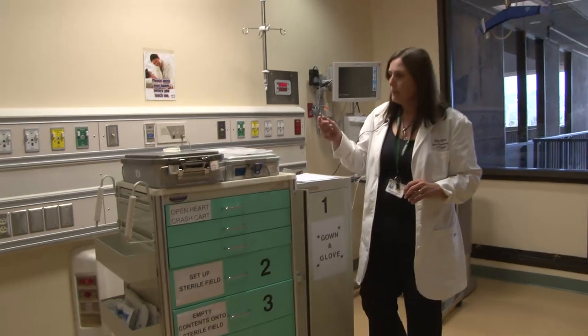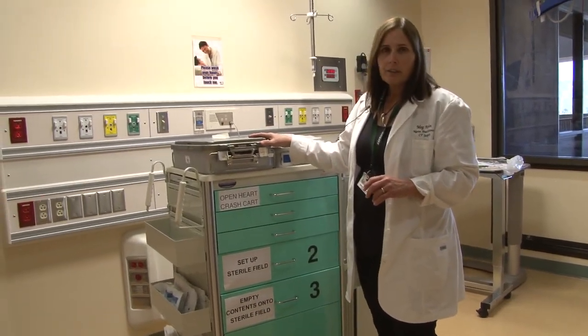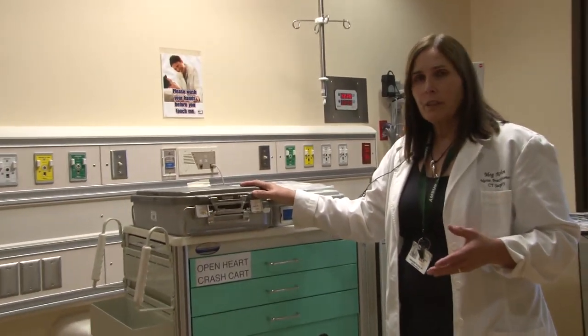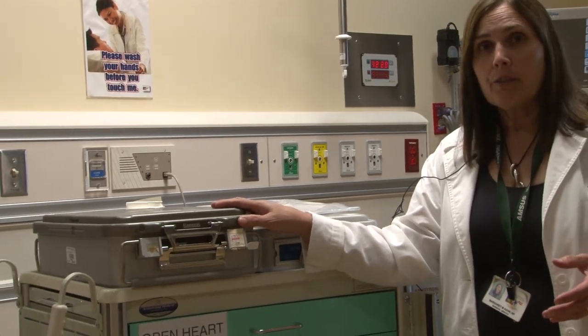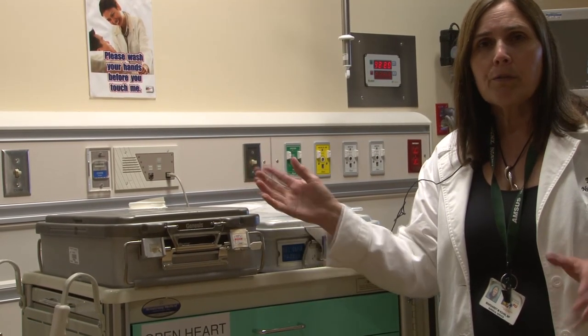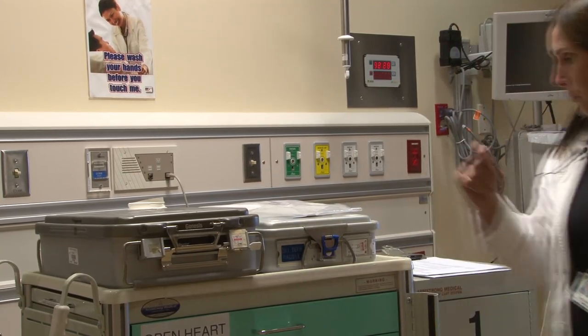Let me show you what's on the CART, starting with what's on top. Here's the large instrument tray. This is the instrument tray that previously was opened for the entire procedure. With the new way we're doing the procedure, we're going to save this large instrument tray until the end so it will keep from getting contaminated. But it is always here and it always has all the instruments in it.